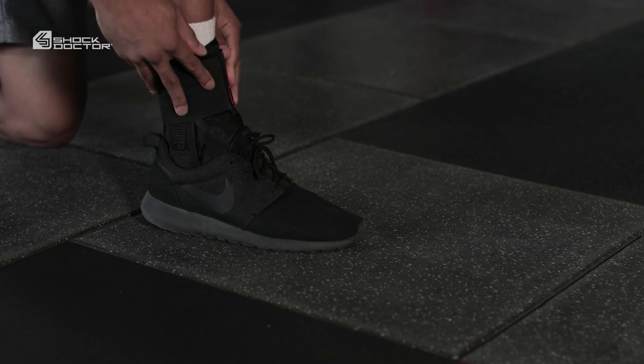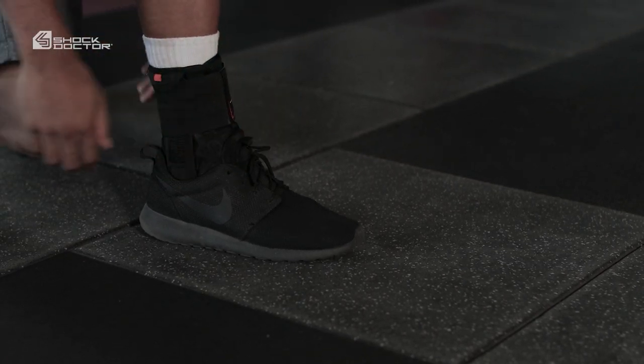Shock Doctor Performance Sports Therapy, like our 851 Ultra Wrap Lace Ankle Brace, prepares you to go fearlessly forward.